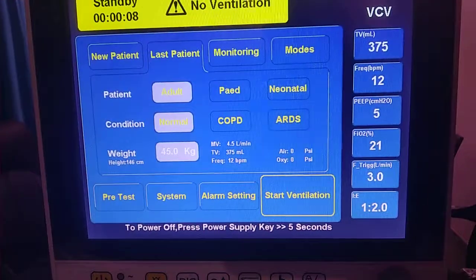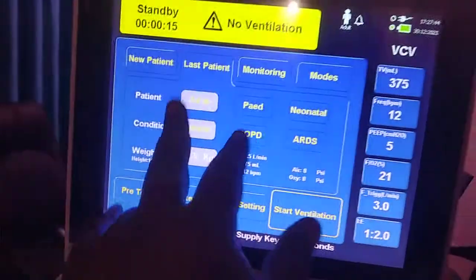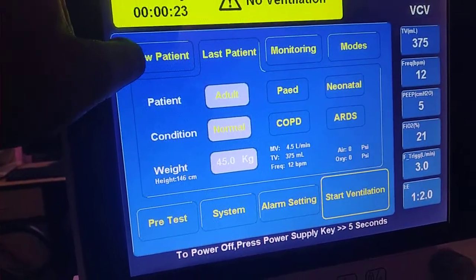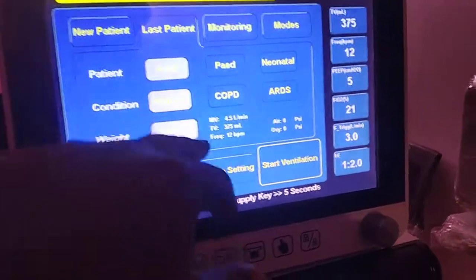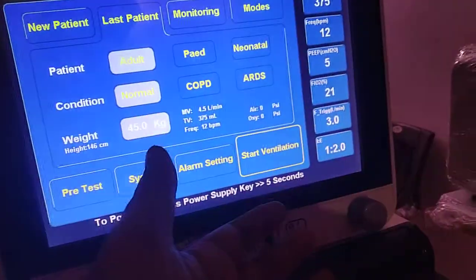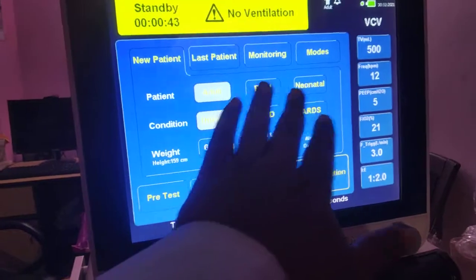This ventilator can be configured as adult, pediatric, or neonatal — this machine is configured for all three patient types. If you have a patient you've just detached from the ventilator and want to continue, it will save the last patient's data and you can directly start ventilation with that data. Or you can select new patient and choose the patient type.